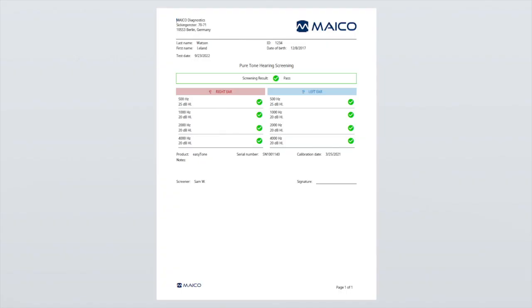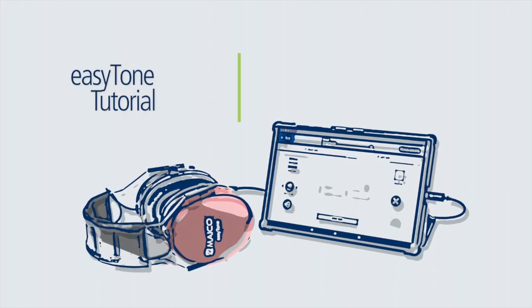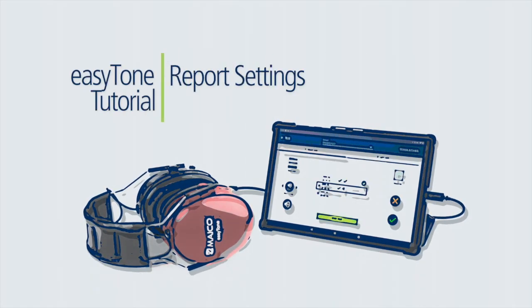The PDF will display the facility and logo at the top of the PDF and the miscellaneous information at the bottom based on the report settings. This completes the tutorial on report settings and how to add facility information. Please continue through the tutorial series for additional EZ-Tone instruction.